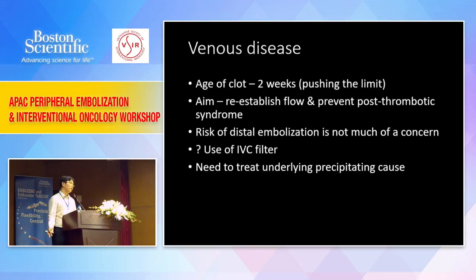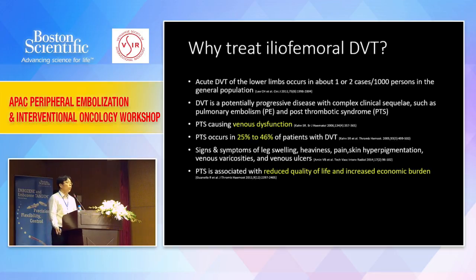Personally, I hate using IVC filters. It is very simple to deploy, but if you happen to deploy it wrongly, it is impossible to get it removed. Okay, and then you need to treat the underlying precipitating cause, and I'll explain to you what that means later on. So now why do we need to treat all this iliofemoral DVT?